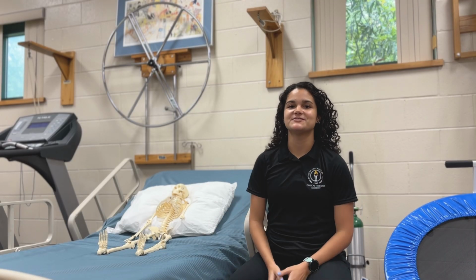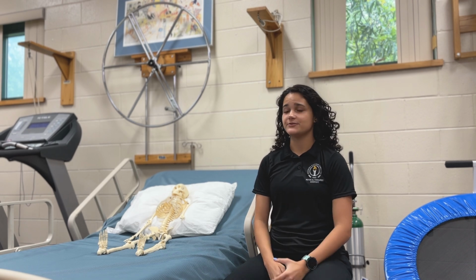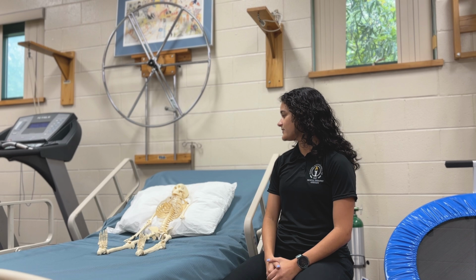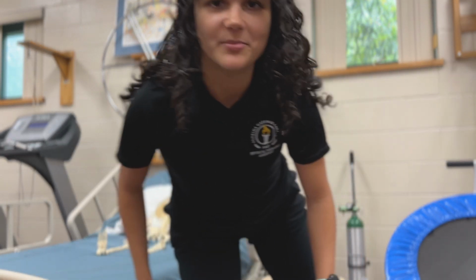I'm really glad you can make it to this video today because today we are going to take Mr. Skella's vitals. Would that be okay if they helped us? He said yeah. Let's go get our equipment.